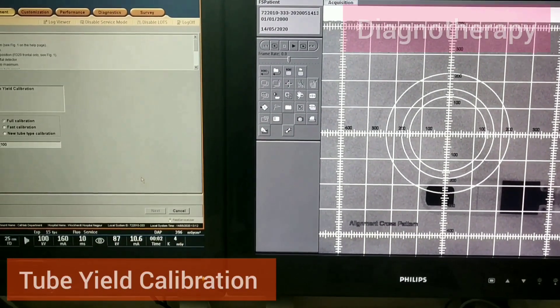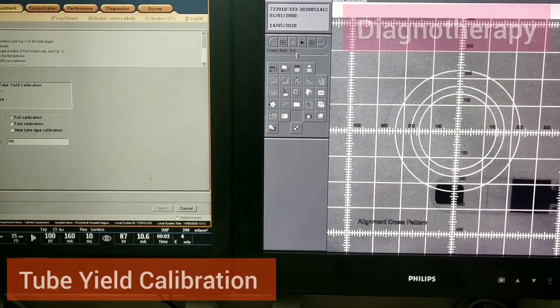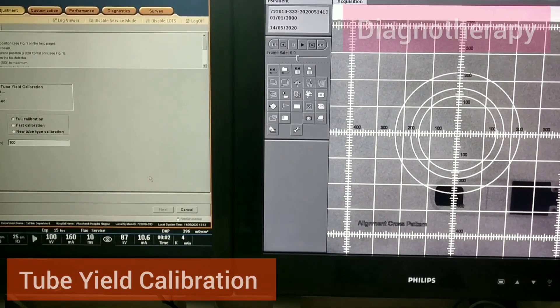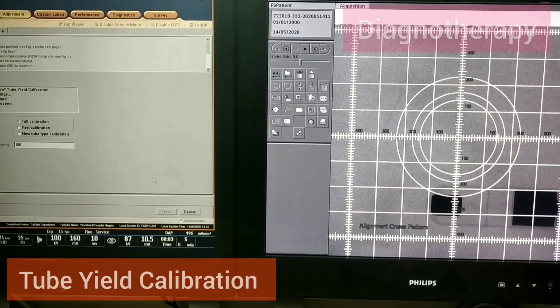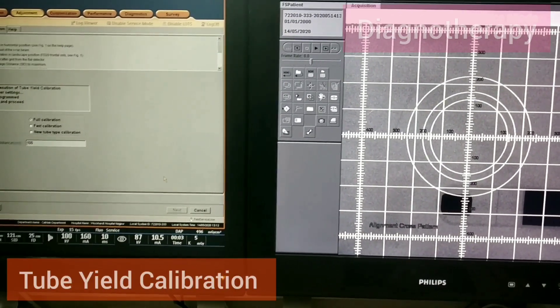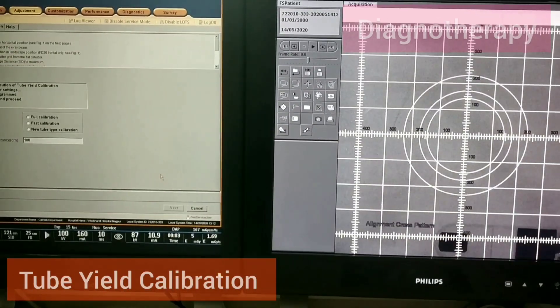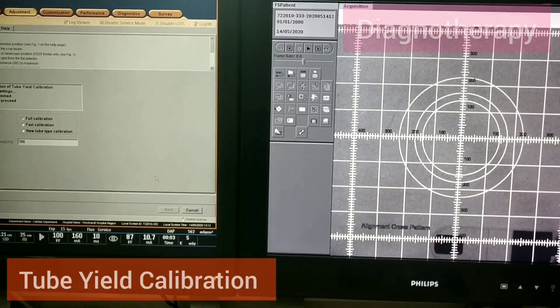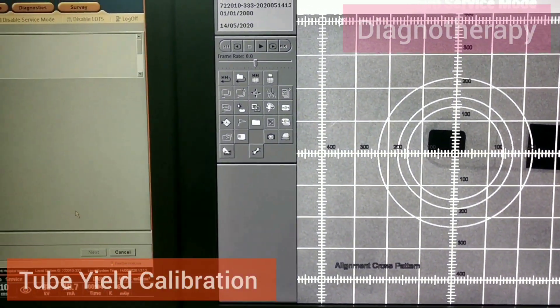Substances with higher atomic numbers appear in black. We continue doing the same in different quadrants, checking the tube yield calibration and shifting positions while checking the readings.